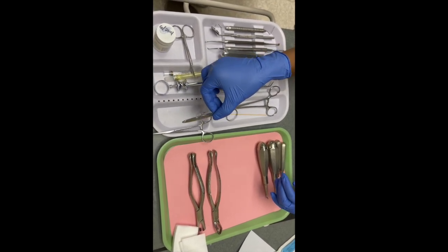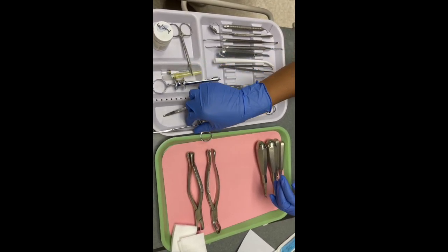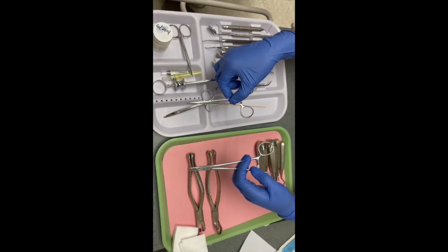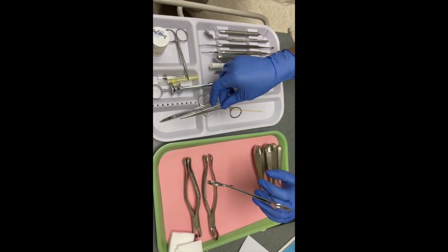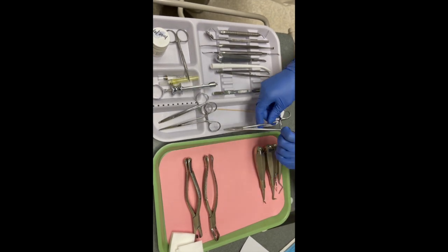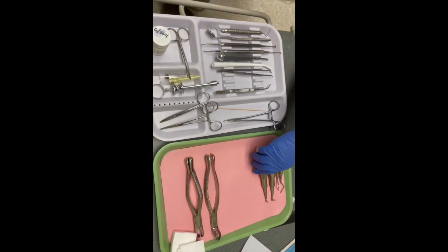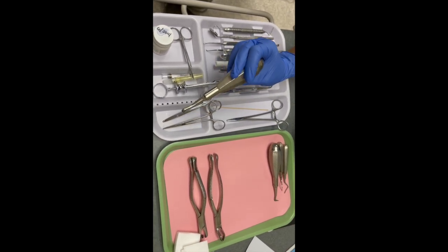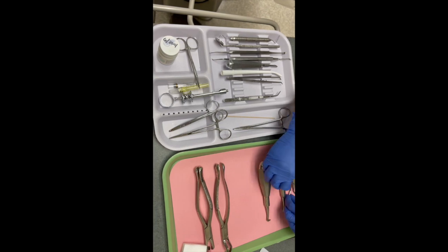Then you have your suture scissors, which helps cut the sutures that you place. You have your hemostat and your longer hemostat, which help remove or place sutures — one of those is for placing sutures you want to just put down. Next you have your root elevator to loosen the root and to separate it from the socket.